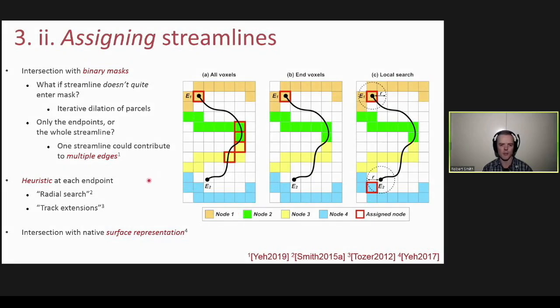The basic premise is that depending on the particular mechanism that you use for assigning streamlines to parcels, depending on the nature of your streamlines reconstruction, and depending on the nature of the parcellation itself, you can get quite drastically different results. I won't go into full details on all of the different options here. It's more a question of, if you're doing structural connectome construction, it's worth being aware that there is actually a step required here. It's not something that happens magically.